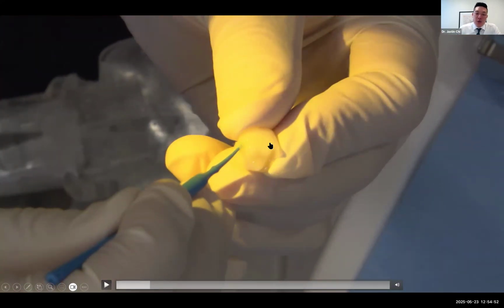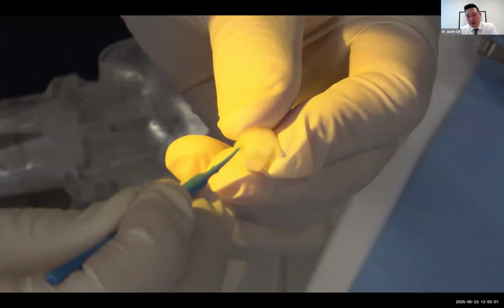Before we air abrade, we'll take a little Sharpie and mark all the way to the margins, all the different surfaces. That way, the game becomes air abrading or sandblasting away all of the color. That's a really good way to determine that you've effectively sandblasted the entire internal surface properly.